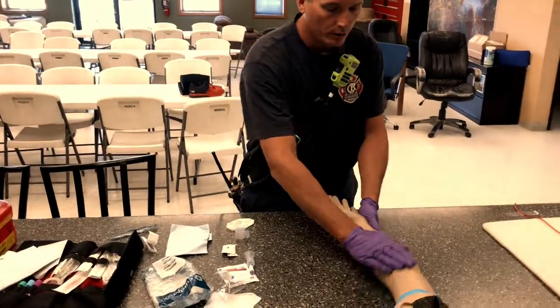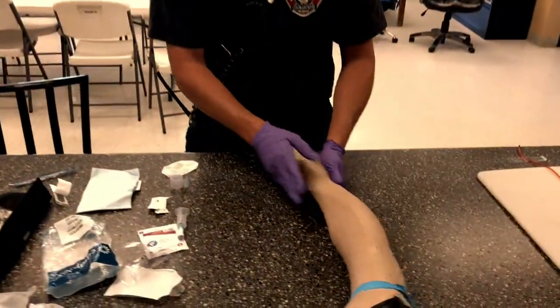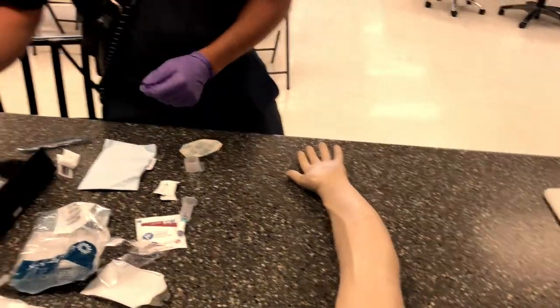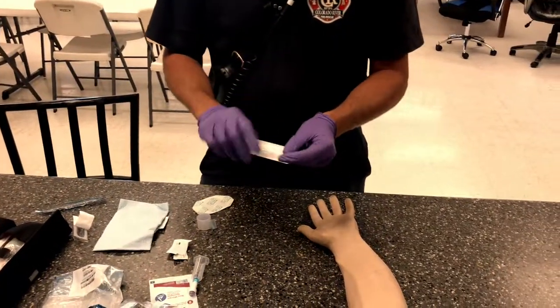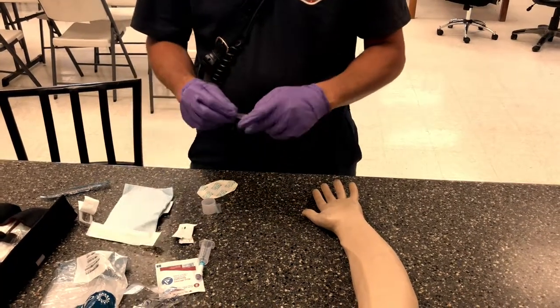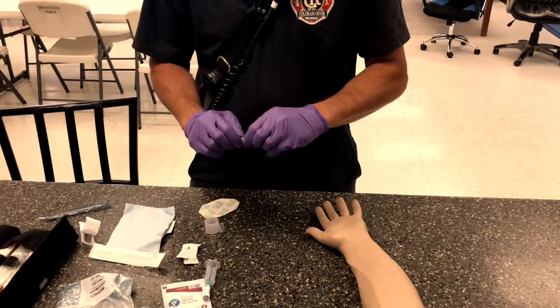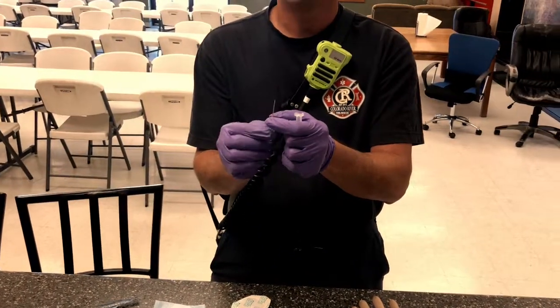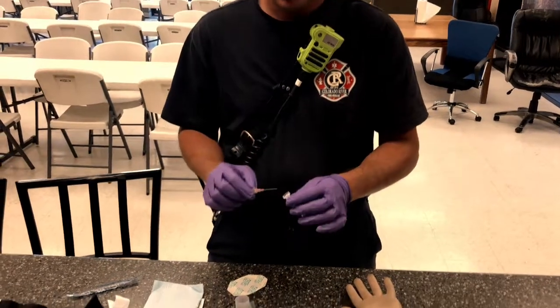All right, so look at IV. We got some really good IVs on this mannequin, so I'm comfortable with an 18, though for training today we're going to use a 20. So identified my 20, it is a 20, it's pink. We remove the protective cap. We can make sure the catheter is loose on there.